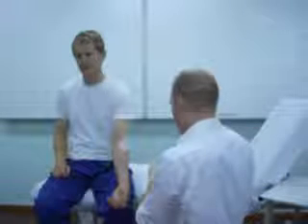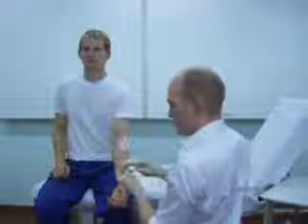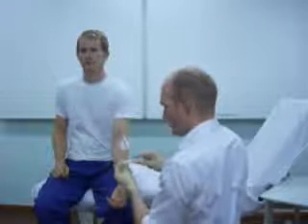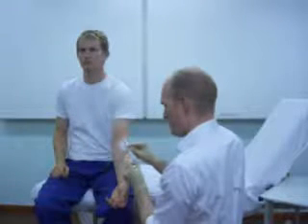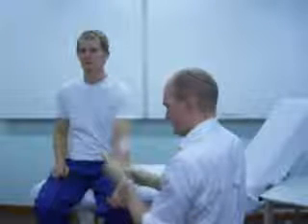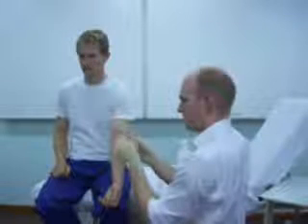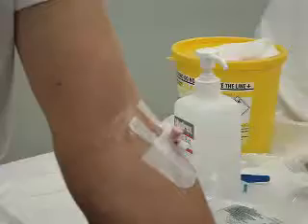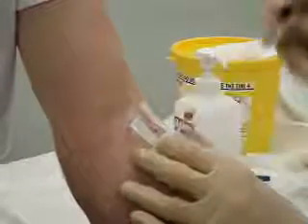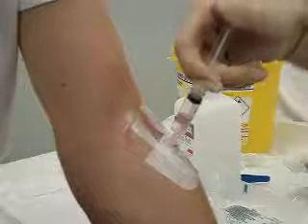So what I need is a syringe, some normal saline, that's sodium chloride 0.9%, expires March 2010. Take that off, draw up a small flush. Make sure I've got all the air out of the syringe, and then simply pop the flush into the arm, and then you can see it's flushing with very little resistance.